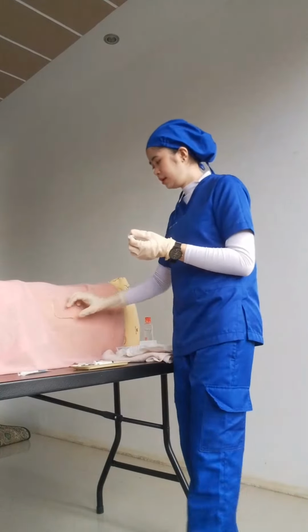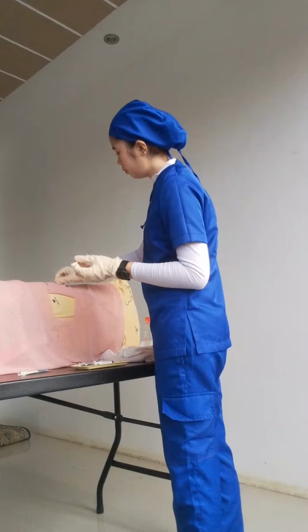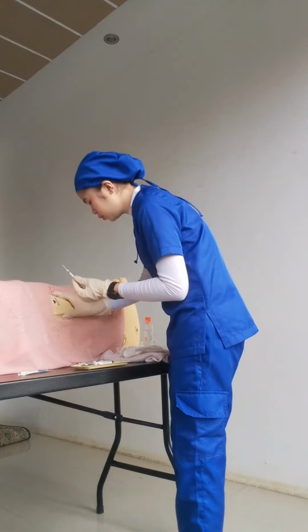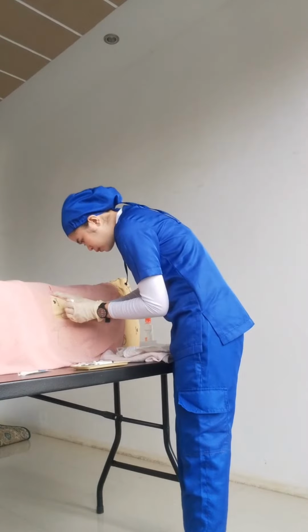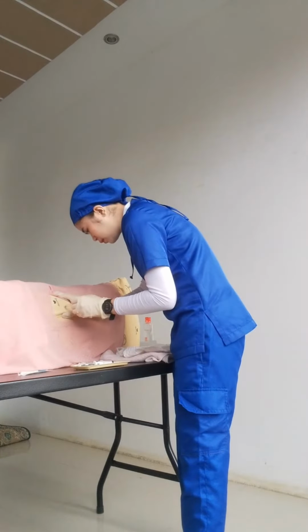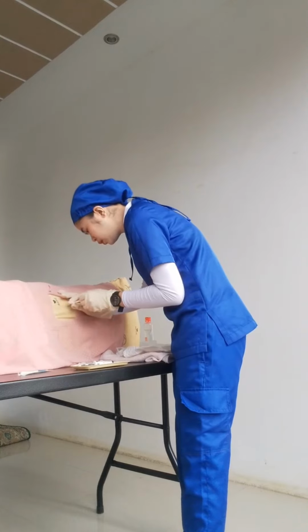Then expose the site of the puncture, and then insert the needle, and after the insertion, withdraw the needle.